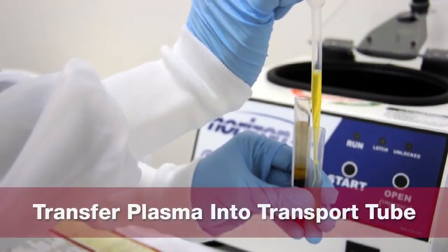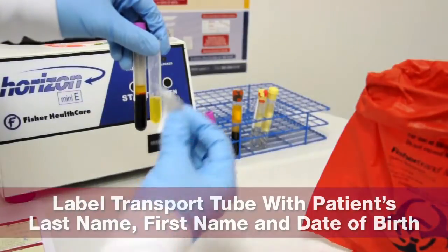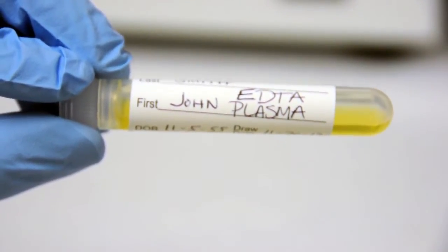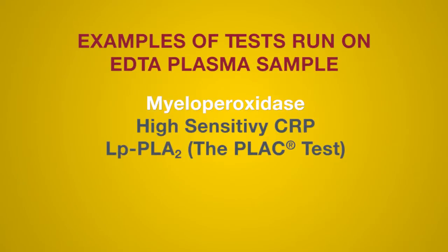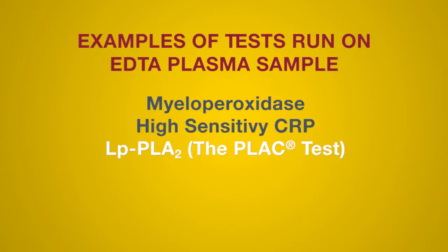Next, transfer the plasma into a transport tube and label the transport tube with the patient's last name, first name, and the date of birth. Write plasma EDTA on the tube. Discard the parent lavender tube. Some examples of tests that are run on the plasma sample are myeloperoxidase, high sensitivity CRP, and LP-PLA2, also referred to as the plaque test.